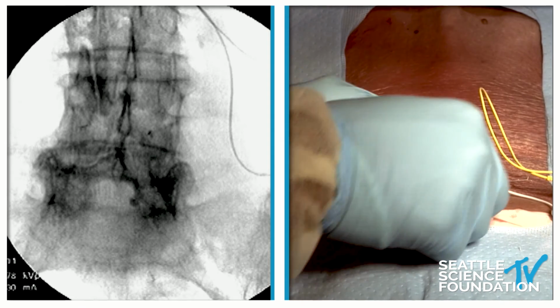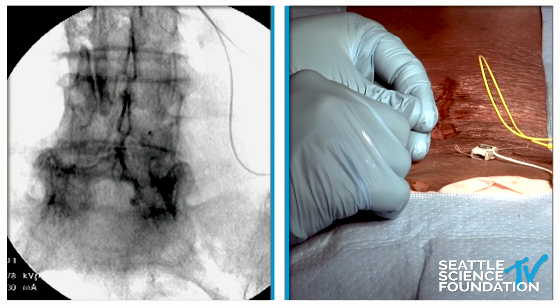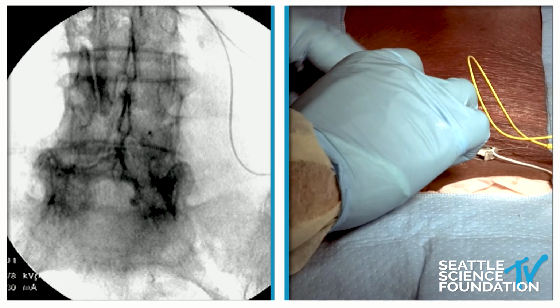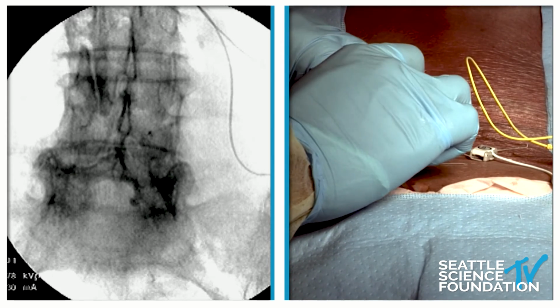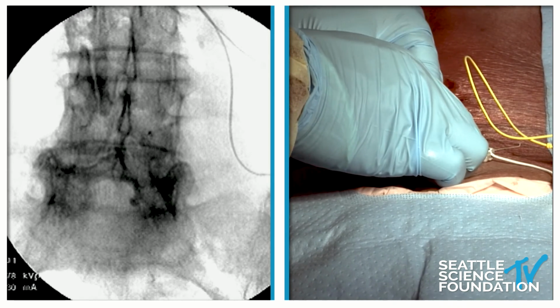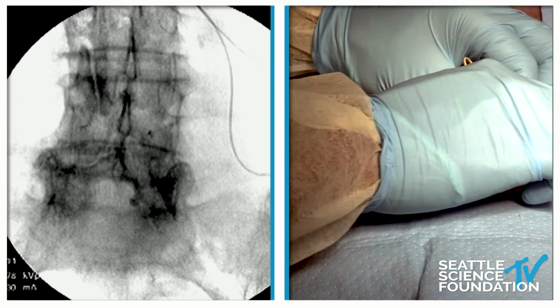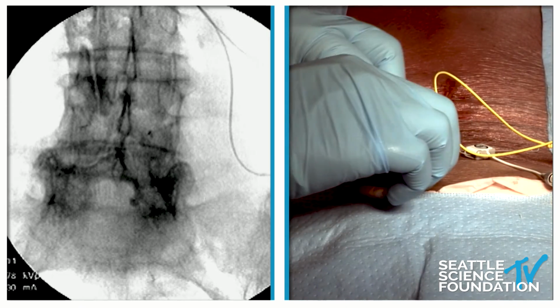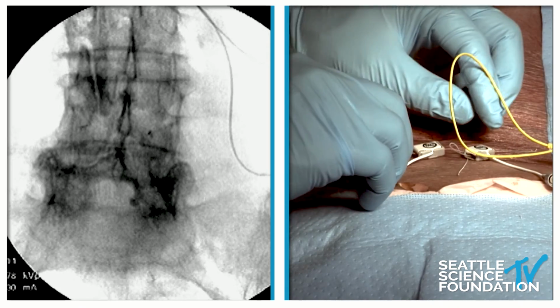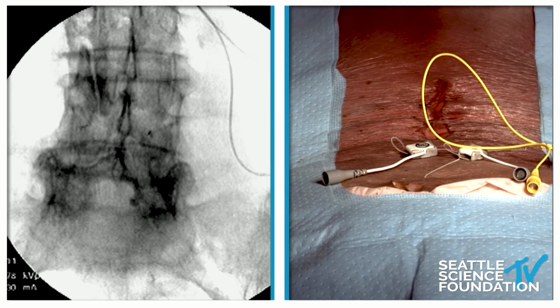And of course, we got the stickiness from all the stuff we've been doing. There we go. That pulls through. About 2.5 centimeters there. And you could pull this out if you really, really tugged, but quite frankly, even if you did a little bit of a tug, because of the elasticity in that tine, it's pretty hard to screw it up. So as you can see here, we got about 2.5 centimeters both sides. So what I like to do is sort of make them even. And you can see they're oriented in such a way. And then we'll cut off the backs of the lead.